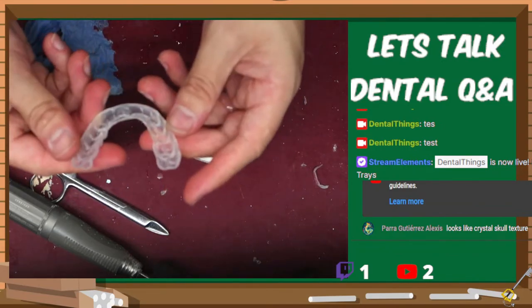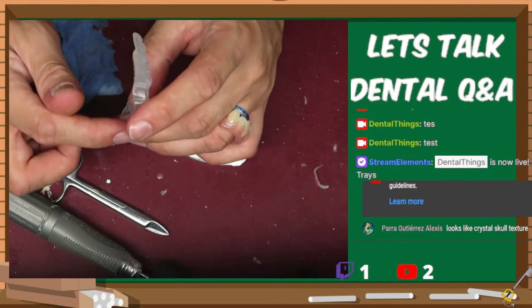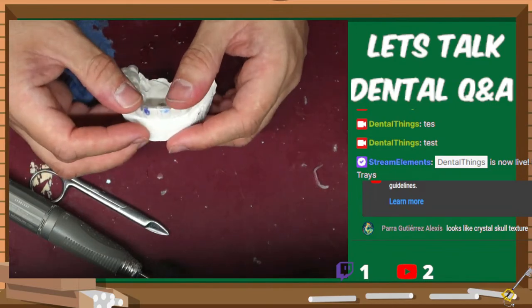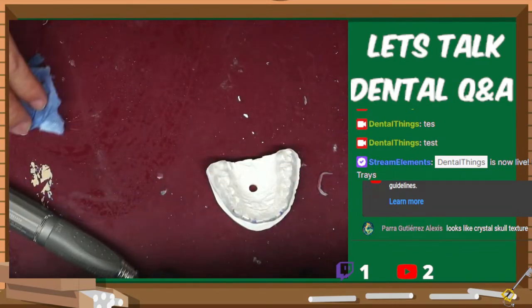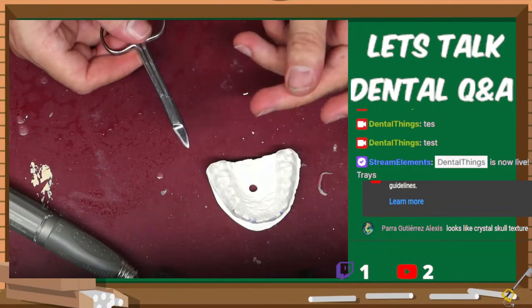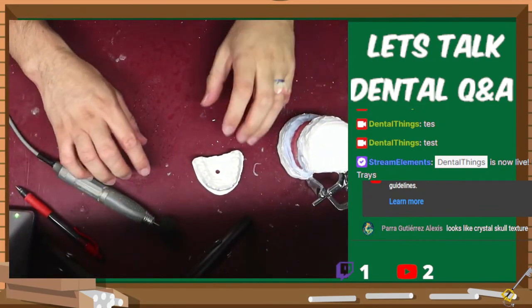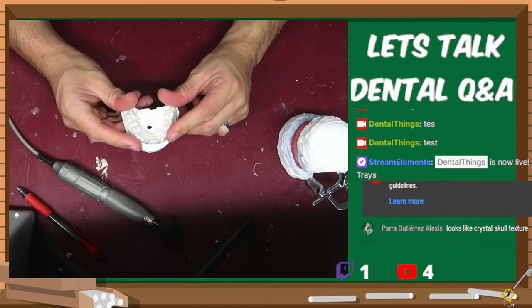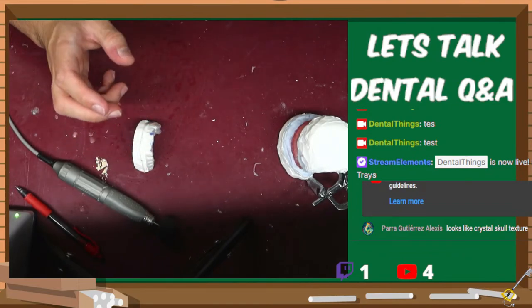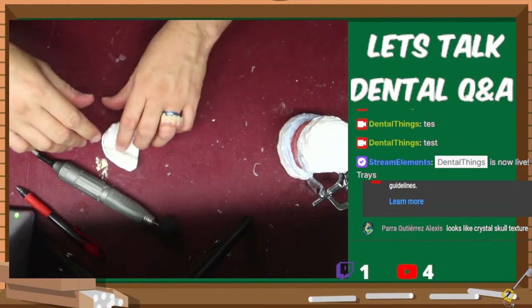And it'll look really pretty. But not bad. Not too bad, cleaned up just a little bit. If I was to put some mineral oil inside of this, it'd really make it look glossy. But I'm just gonna put it on the model just for now. Go and clean up my little area for now. I don't need my scissors anymore. I can back up the image a little bit. Cool. For the most part, I believe I'm done with this, but I need to polish it, like I mentioned. So, I don't need my glasses anymore. Pretty safe, nothing's gonna fly up into my eyes anytime soon, which is cool.